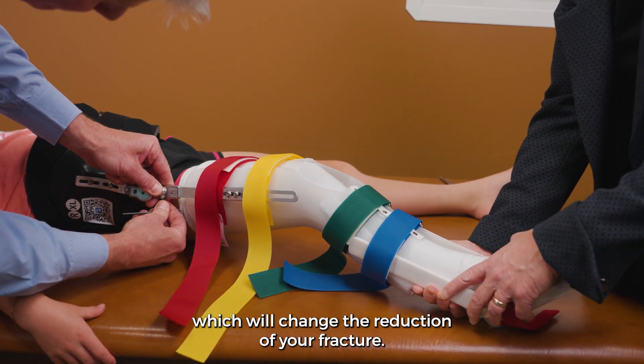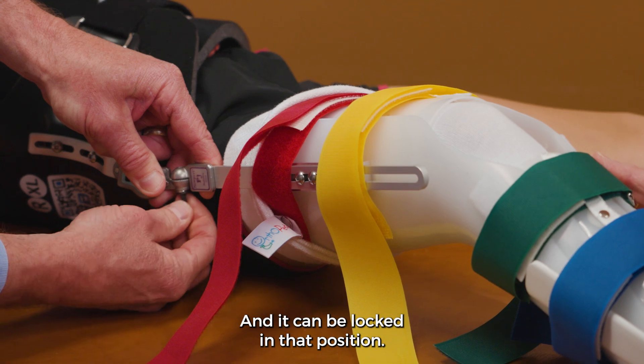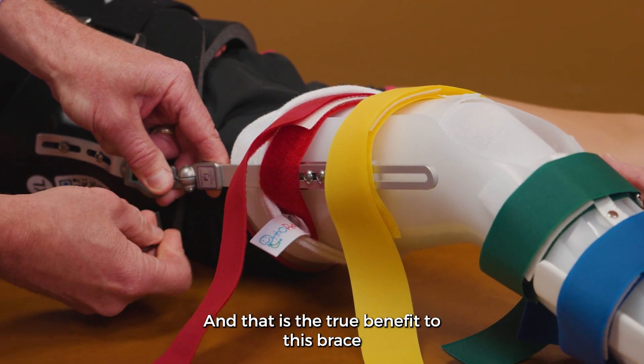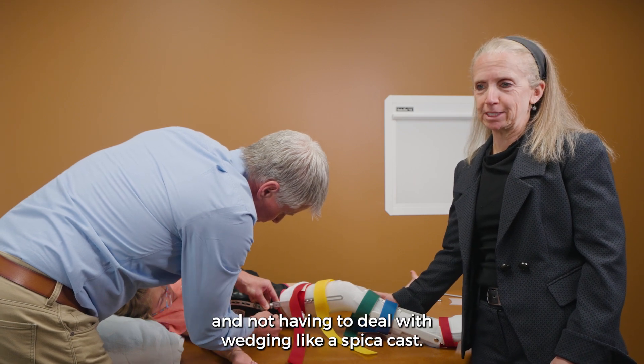Now we can abduct her leg, which will change the reduction of the fracture, and it can be locked in that position. That is the true benefit to this brace — being able to make adjustments and not having to deal with wedging, like with a spica cast.